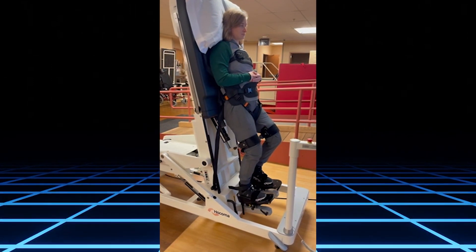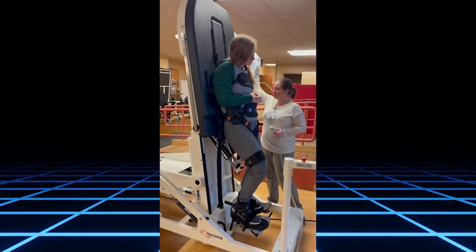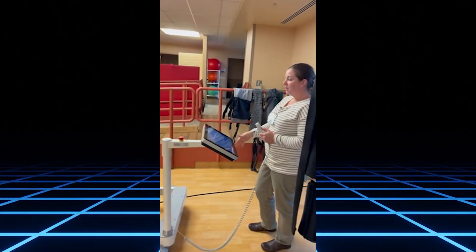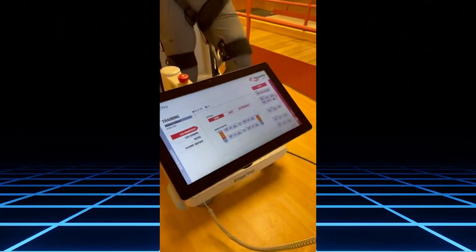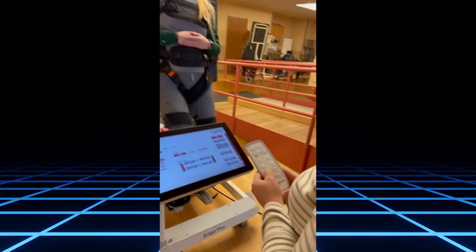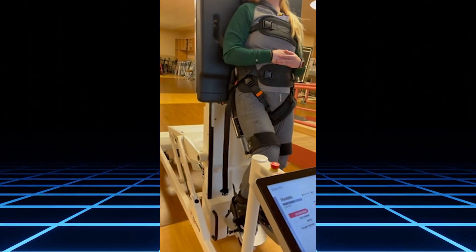The goal for this patient is to get her to the full upright position. Oftentimes I will remove the pillow when they are fully upright. If they are in a crouched position, which frequently happens, you can use this button here to make the leg length longer for the patient to appear in a more upright position.